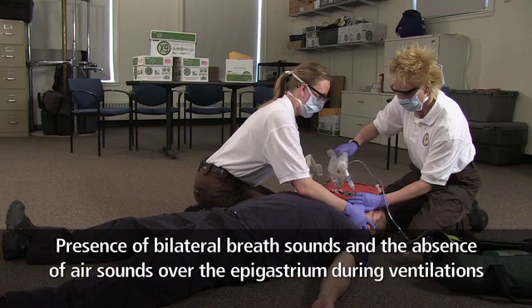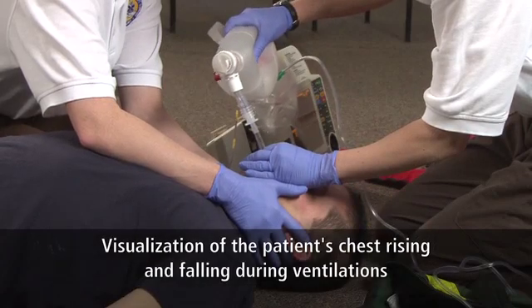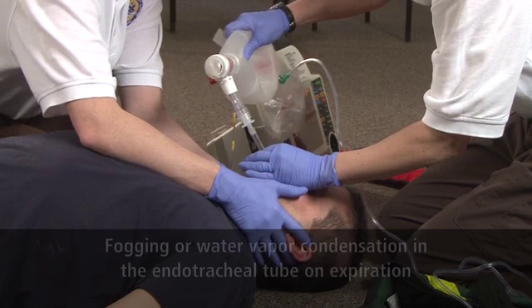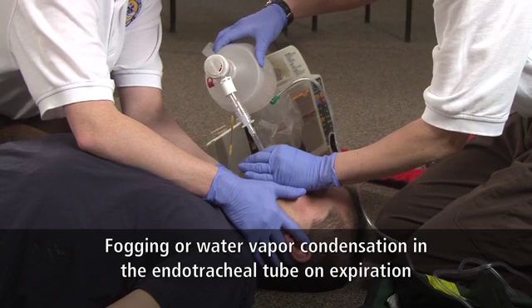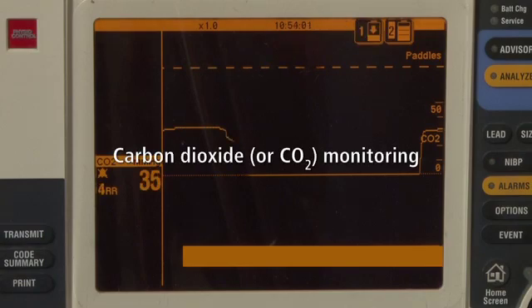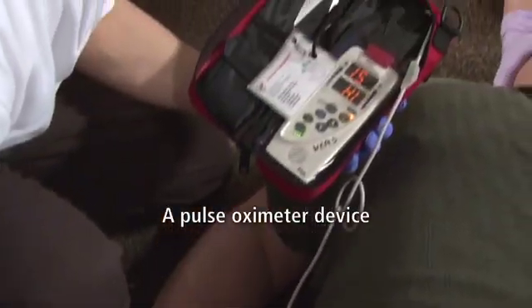presence of bilateral breath sounds and the absence of air sounds over the epigastrium during ventilations, visualization of the patient's chest rising and falling during ventilations, fogging or water vapor condensation in the endotracheal tube on expiration. Adjunctive devices include the following: carbon dioxide or CO2 monitoring to include end-tidal CO2 monitoring or capnography and colorimetric CO2 detector, a pulse oximeter device.